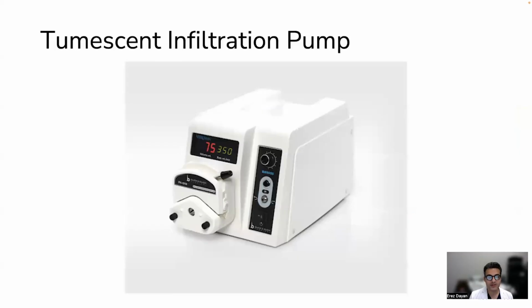Now, when we inject the tumescent, depending on the patient, you can either inject it on a tumescent cannula that luer locks onto a 60 cc syringe, and just with your scrub tech, pass syringes. I like that technique because it gives you more control.